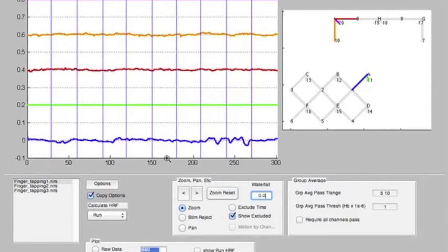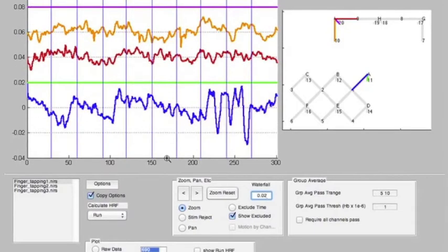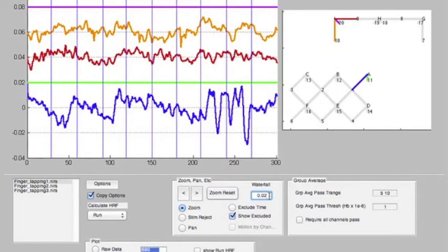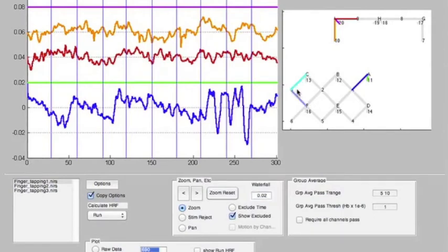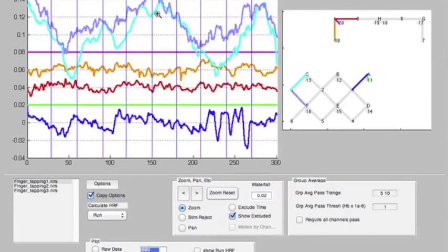Actually, I meant to say 0.02. So let's try that again. This is now a classic waterfall plot, which displays all the channels of data separated by whatever amount we indicate in this text box. This makes it easier. If you want to shift-click, we can display multiple additional channels of data.